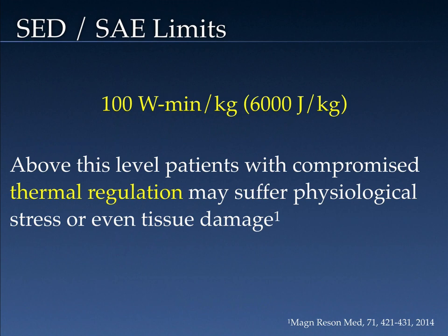To my knowledge, I am not aware of any papers to date that have been published showing human tissue damage from clinical doses of RF that we use in routine MRI imaging today. Nonetheless, these levels have been adopted by the IEC.